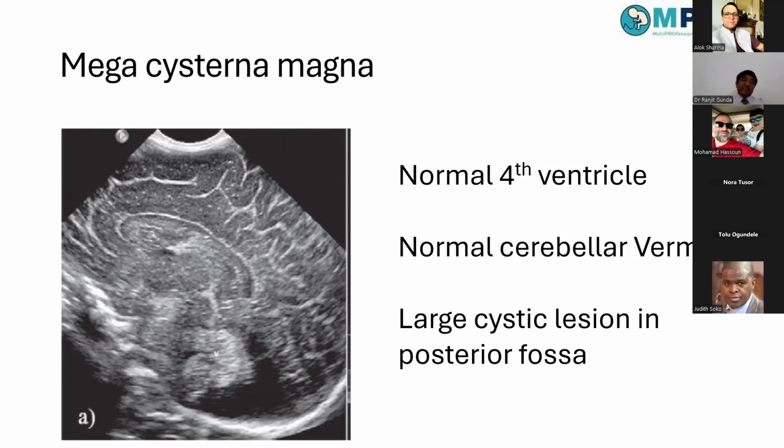All these babies will need further neuroimaging with more detail. But when we see babies with neurological symptoms in the newborn period, or babies with hydrocephalus in the first scans, as a bedside ultrasound scan we can look into these structures that might guide us towards the diagnosis.